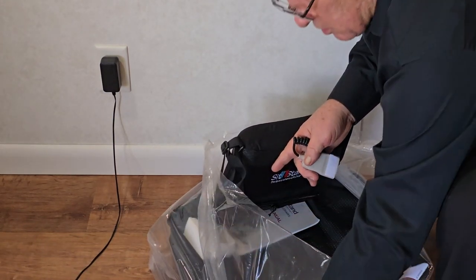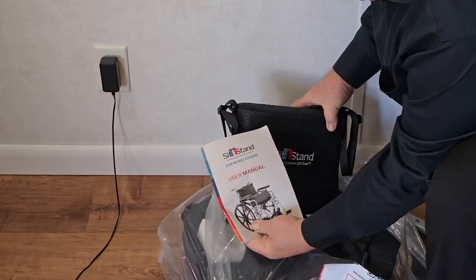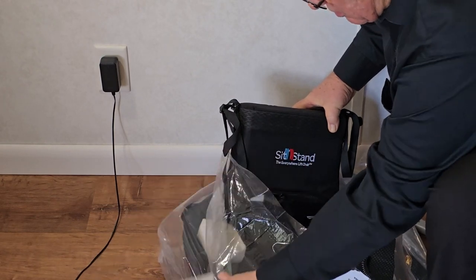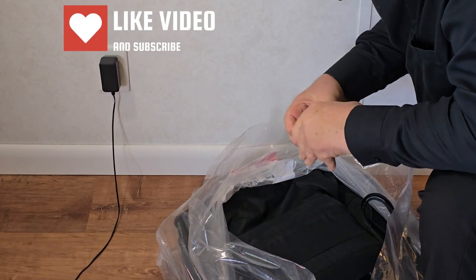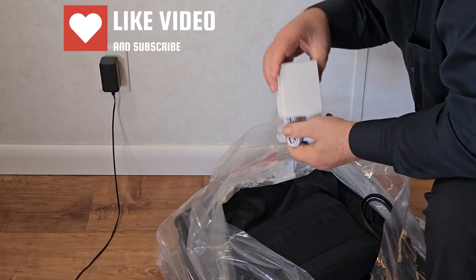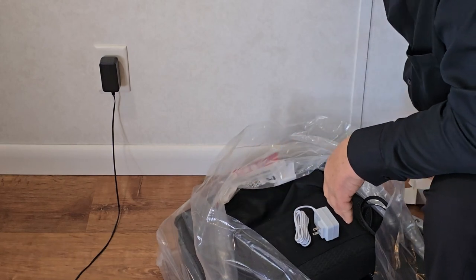It talks about how to use the remote, so we'll unpack that. Then we have the instruction manual that talks about how to use it — we'll set that aside for a minute. In this little box, this would be our power supply.